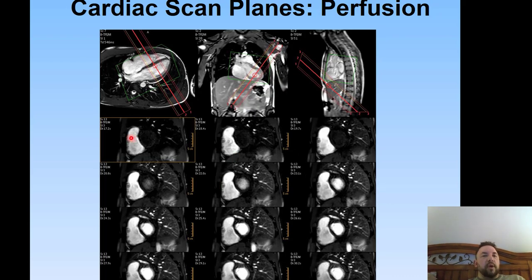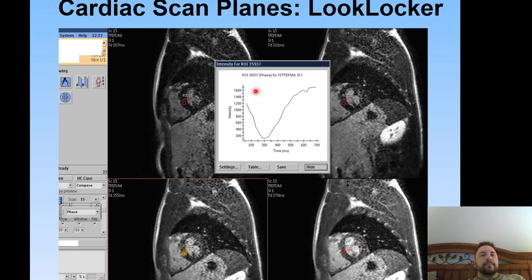Then at 4 mLs per second, around mid-ventricle, we want to rapidly inject the contrast so that we can see the arrival and exiting, the entry and exit, throughout the chambers. 10 minutes after the injection of contrast, we're going to perform what's known as the LGE sequence, or the late gadolinium enhancement. So 10 minutes is the earmark for when you want to acquire your post-contrast sequences.